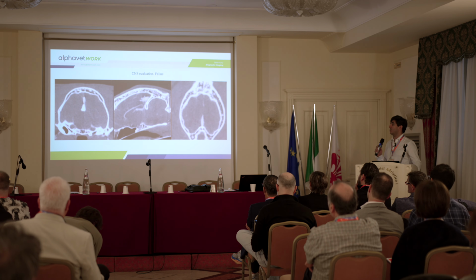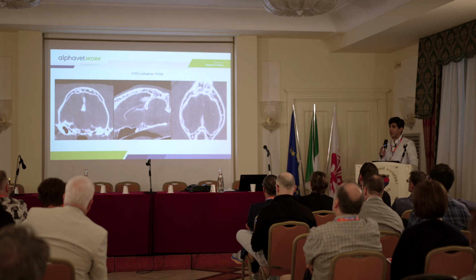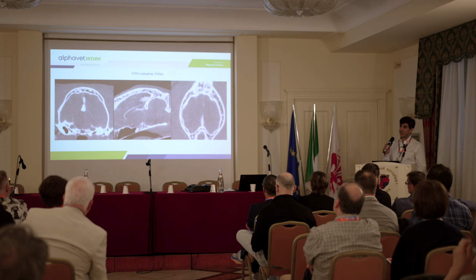This is a very nice case. My resident lost the lesion. This is a small, early meningioma in a feline patient. It was a routine.